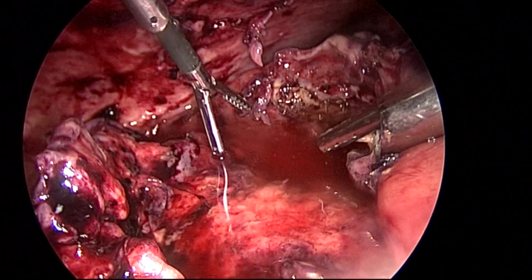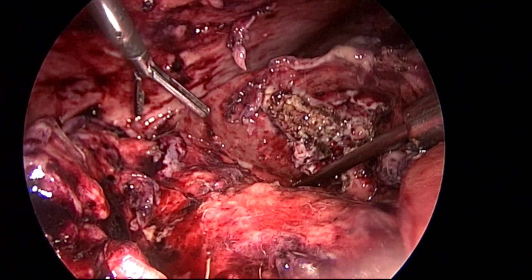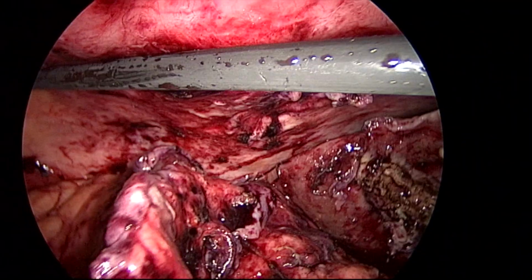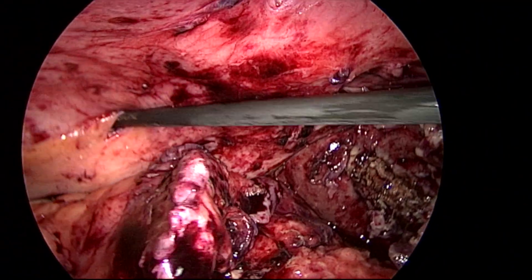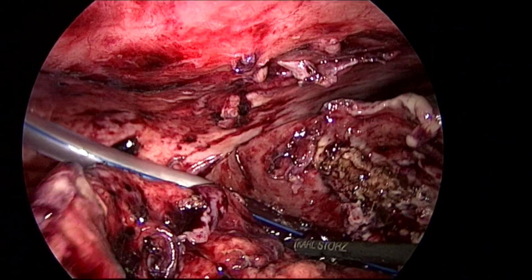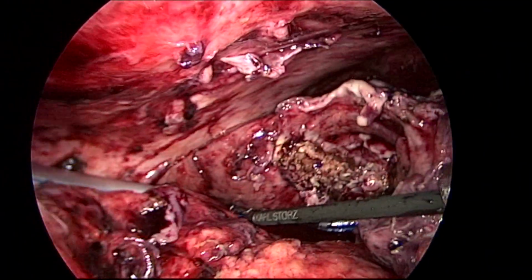And I keep a drain. In this case, even though the duct and artery are clipped, a drain is a must. And I give a lot of wash. So the entire subdiaphragmatic, subhepatic space and left diaphragmatic space, everything is washed. And then I keep a drain.